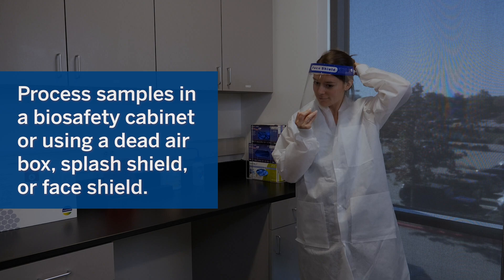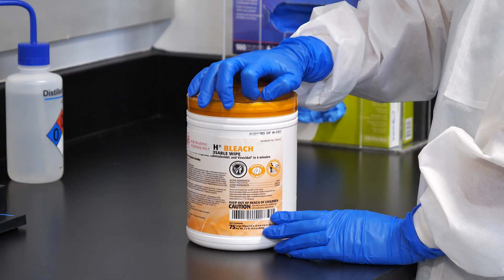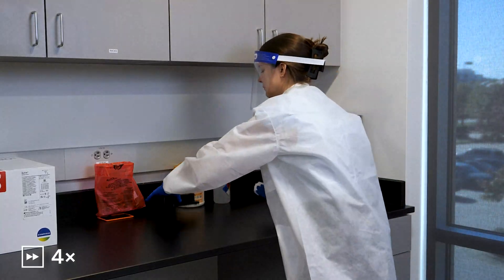If a biosafety cabinet is not used, a dead air box, a splash shield, or a face shield can be used when preparing samples instead. Process samples in a dedicated work area. Clean the area and pouch loading station with 10% bleach and wipe disinfected areas with water. Handle samples one at a time, always changing gloves between samples.